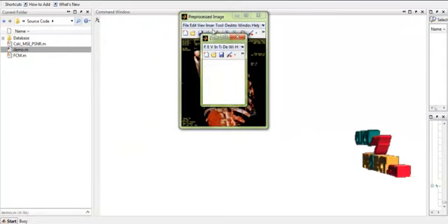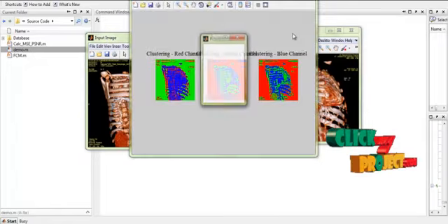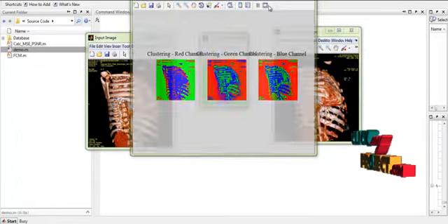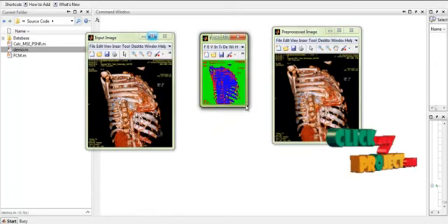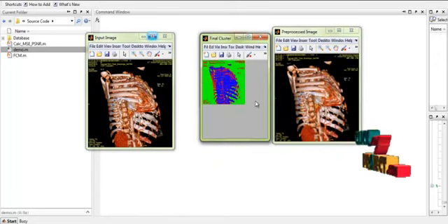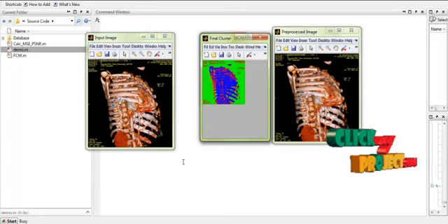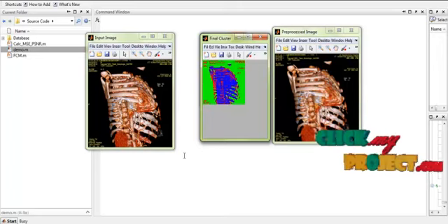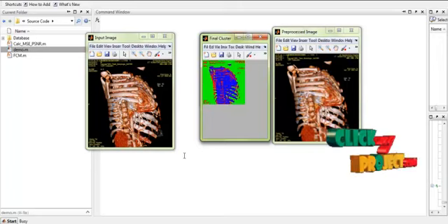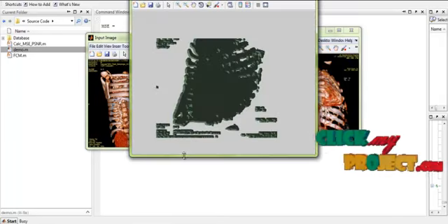First the input images are taken and pre-processed. After that, the images are decomposed using discrete wavelet transformation, and the clustering process is employed using kernel fuzzy C-means, and the extracted clusters are obtained as shown in the display.